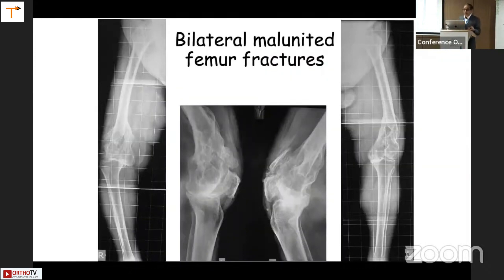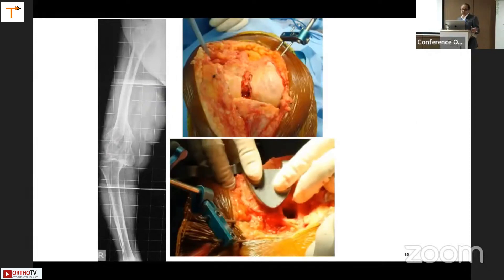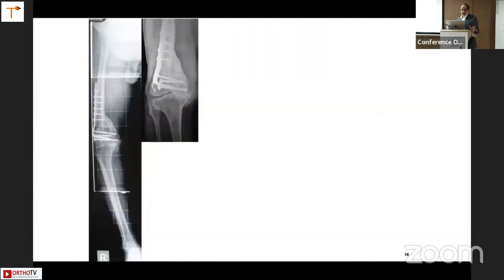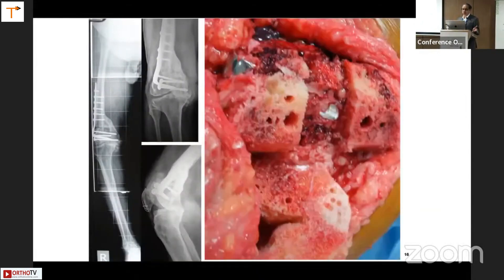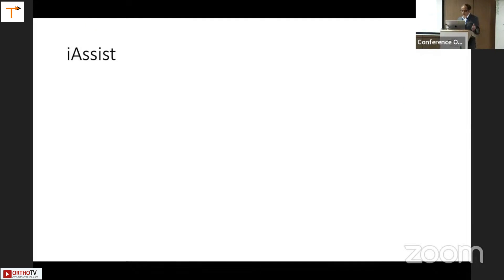Especially for complex cases — malunited femur fractures — you obviously had to use technology, and using it you could manage many of these cases. As you can see, the alignment is achieved and the mechanical axis is achieved. You can even do it totally without removing the implants, and that is possible because of this navigation. That is the postoperative result.